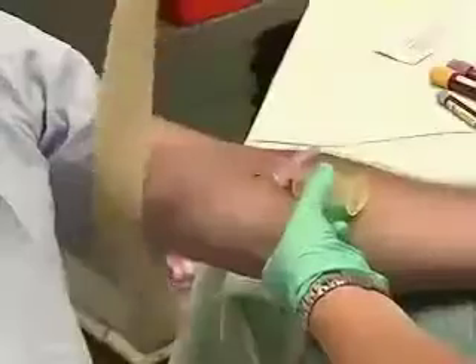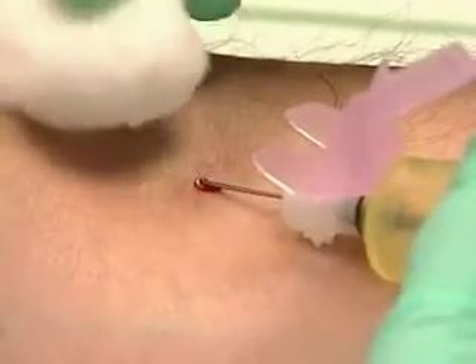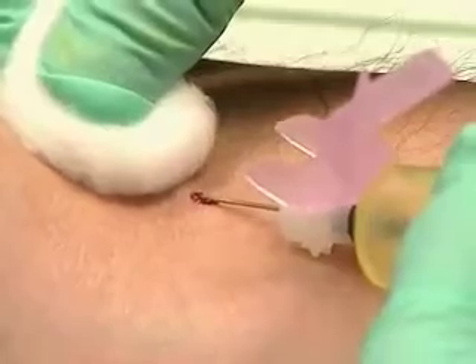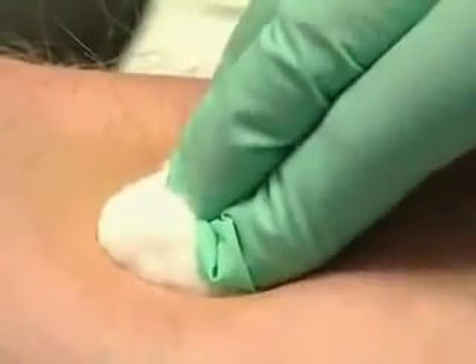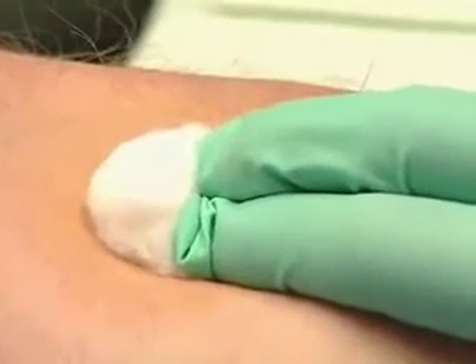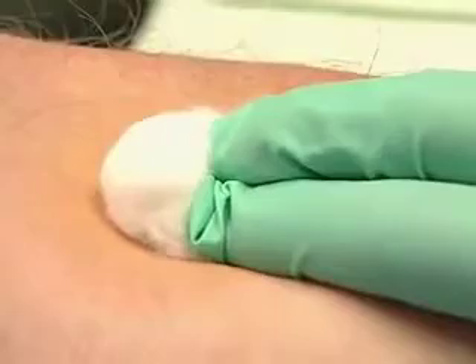As we finish, one pull of the tourniquet, place the cotton ball above the puncture site — not directly on the needle. Withdraw the needle straight back and roll the cotton gently over the puncture, applying steady pressure. Having the patient bend at the elbow to hold the cotton in place can create unnecessary bruising.